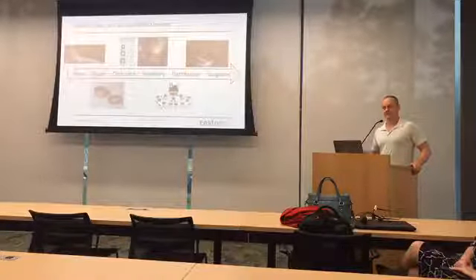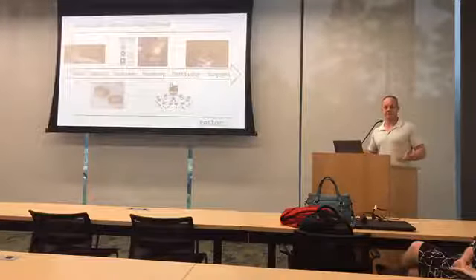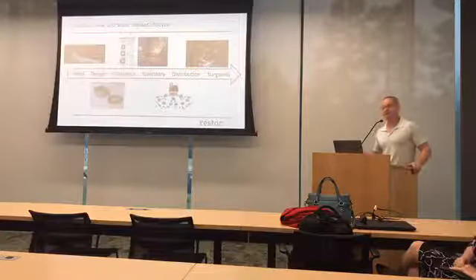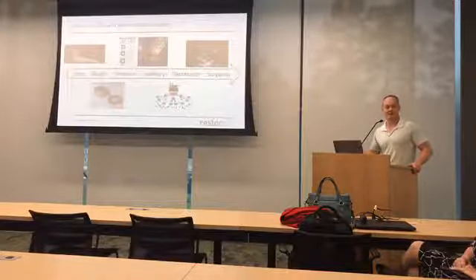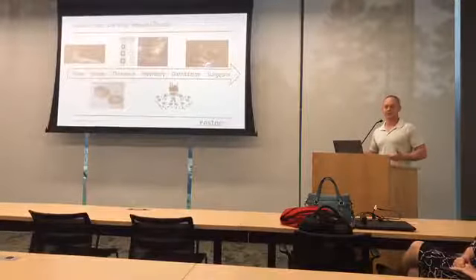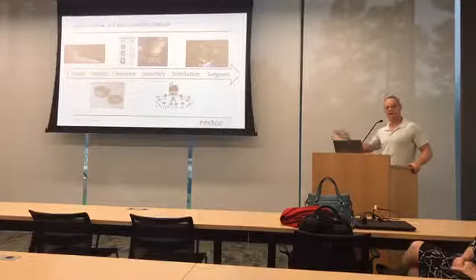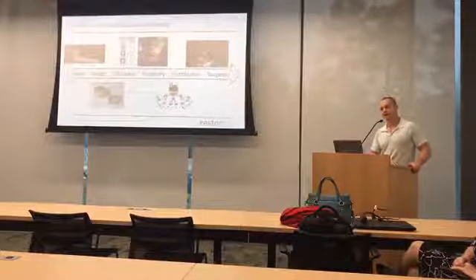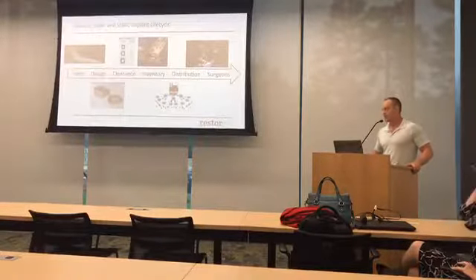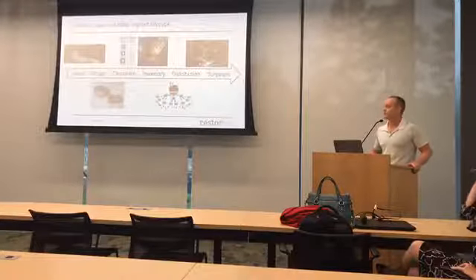The problem is there are two problems with this. One, it doesn't necessarily match the patient's needs. So the inventory that's sitting out in the field won't match those two patients that I had needed. In some cases it matches the patient needs, but the surgeons don't like it. So you're kind of stuck in a dilemma where you either don't match what the surgeon wants or you don't match what the patient needs. And in medical implants, those are both your customers. And there are others like the hospital that have stakes in it. But you're really making things for patients, but you're also making things for surgeons. And so we really want to change that. And this is the way that every single medical device company does it right now.